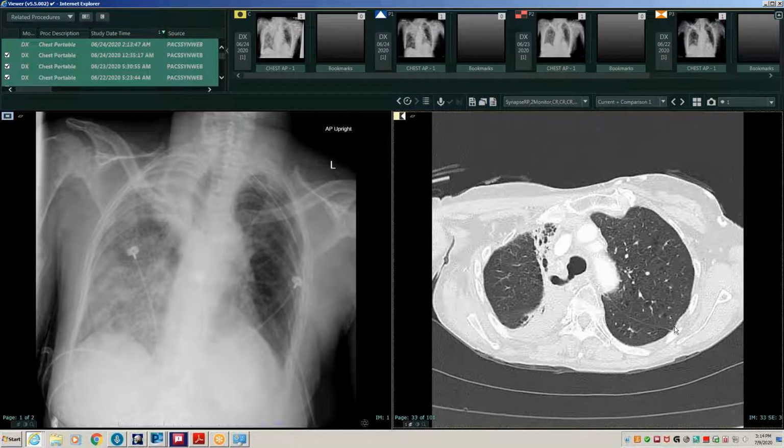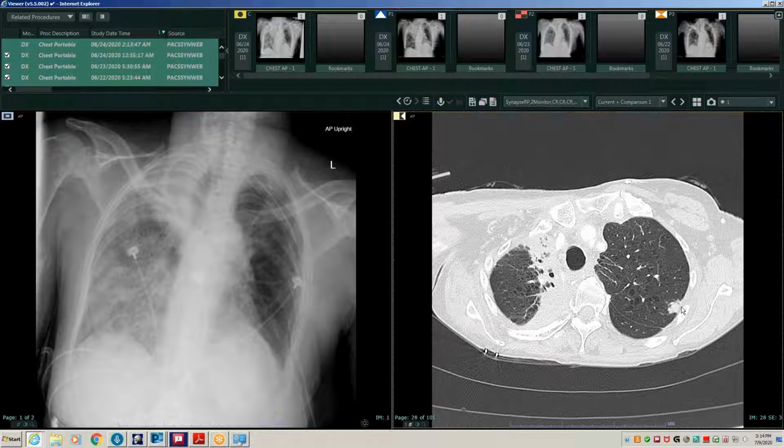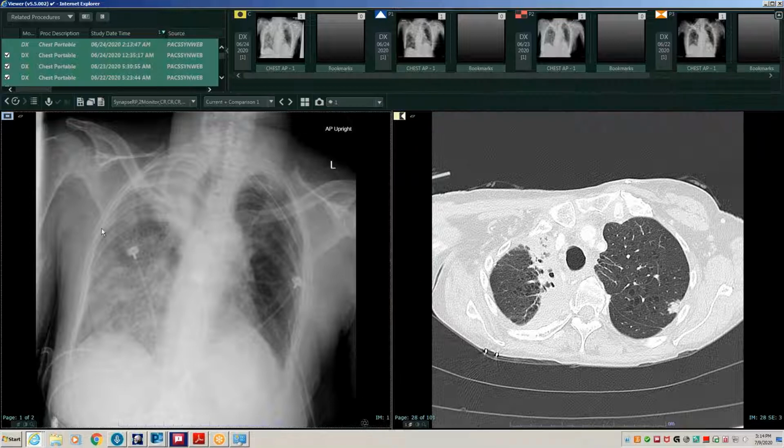And then she had a new cancer here in her left upper lobe. And the thoracic surgeon wanted to treat it with SBRT, but the patient was quite adamant that she wanted it out. So, and she met criteria to have the surgery. So she went ahead with the surgery and did a left upper lobectomy. So this is the post left upper lobectomy chest X-ray, and this is on day 2 post-op.